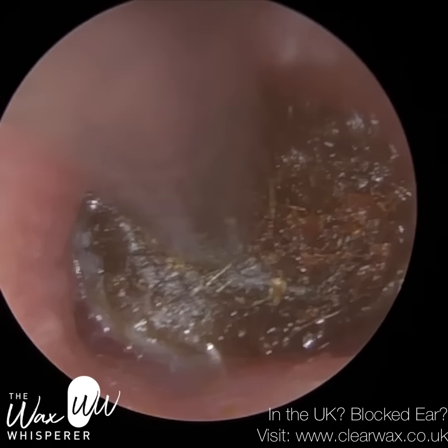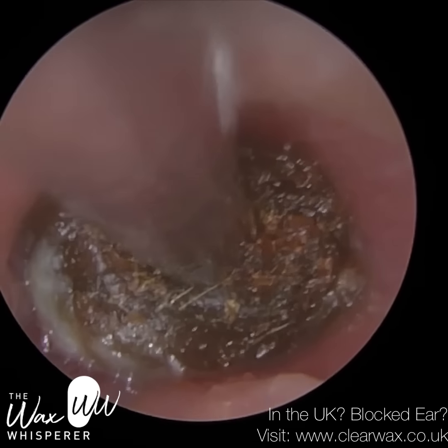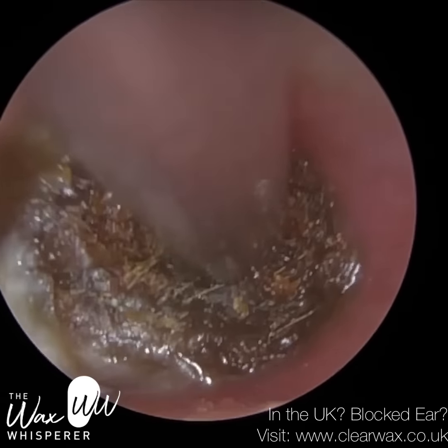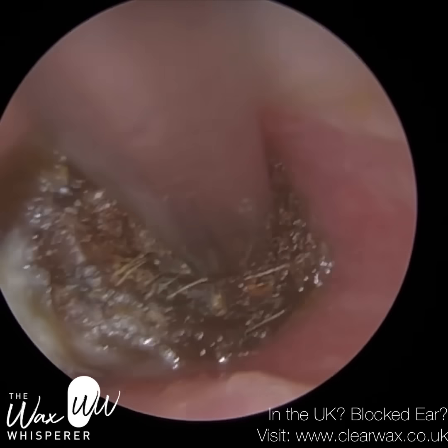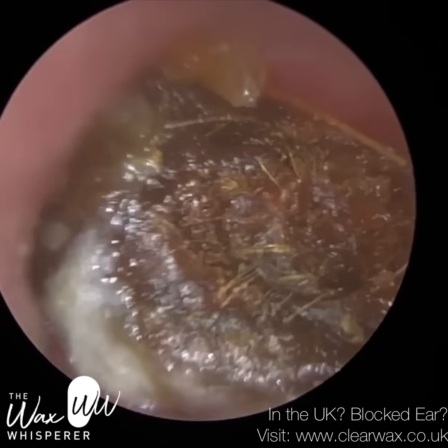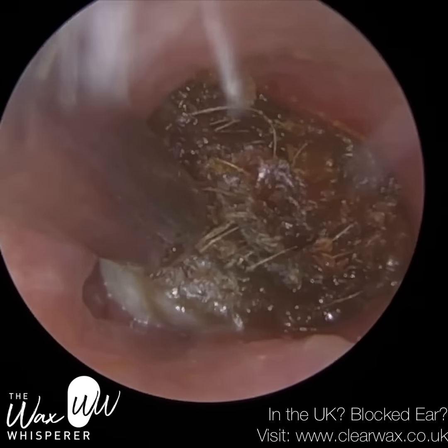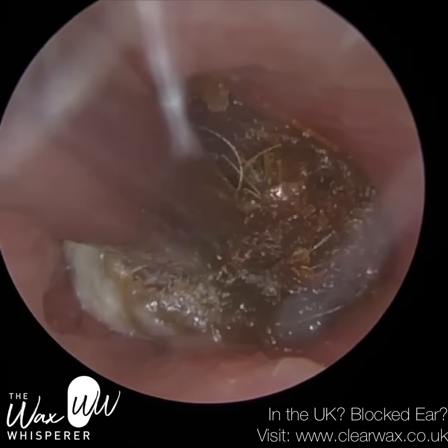And I've just got a suction grip. I'm trying to wriggle this left to right, but because this plug, and this is probably something I should have explained in a bit more clearly and in detail, this plug that I'm removing is larger in diameter than the ear canal in front of it. So the best analogy I can give is imagine when you're constipated and you're trying to force stool out, and it's dry and it's hard and it can be painful. And it's the same for this patient. So the patient already attended with pain, so we're removing this whilst it's painful inside the patient at the end.